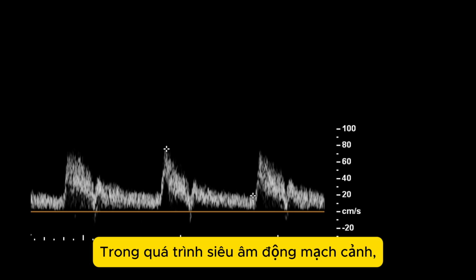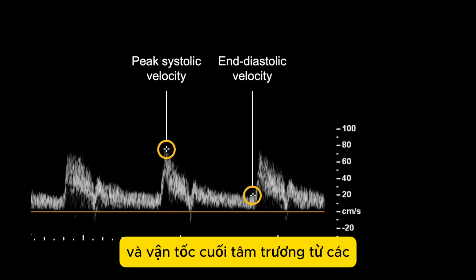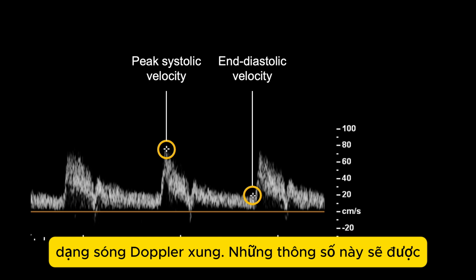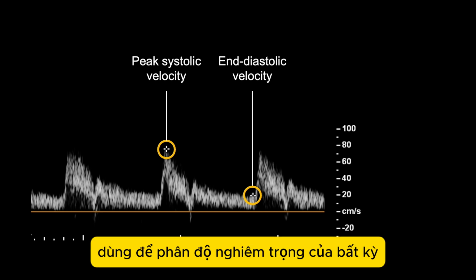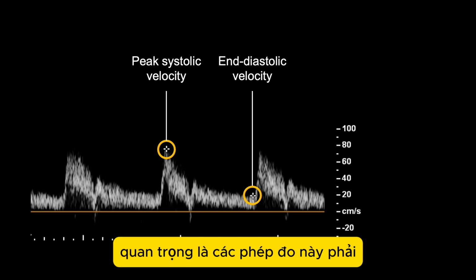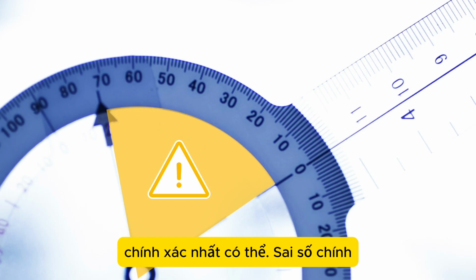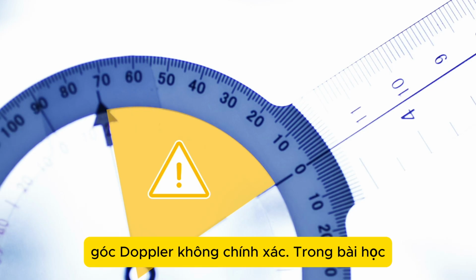During a carotid ultrasound investigation, you will need to measure the peak systolic and end diastolic velocities from the pulse Doppler waveforms. These will be used to grade the severity of any hemodynamically significant internal carotid artery disease, so it's really important that these measurements are as accurate as possible. The key error in velocity measurements is having an incorrect Doppler angle.